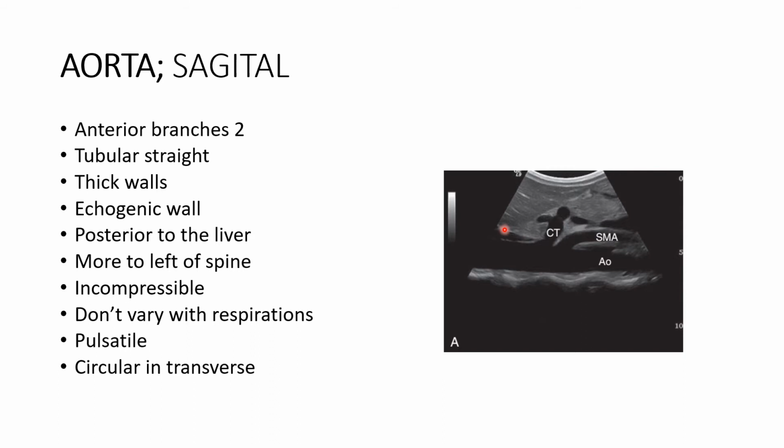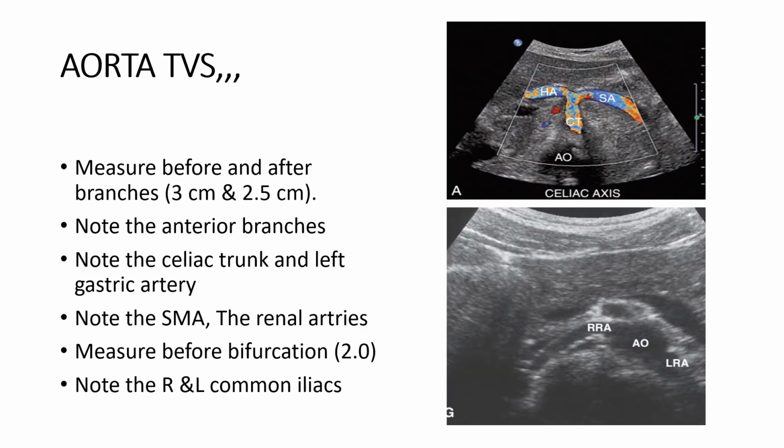When you're scanning from the midline, it lies slightly to the left of the spine. It is incompressible, doesn't vary with respirations, and it is pulsatile. When you go to a transverse image, it appears as a circular anechoic structure. Measurements: before giving these branches, it measures 3 centimeters and less.